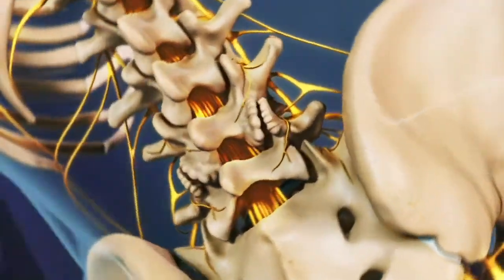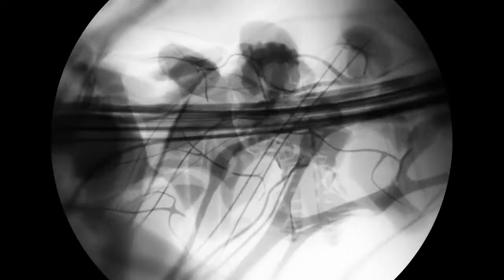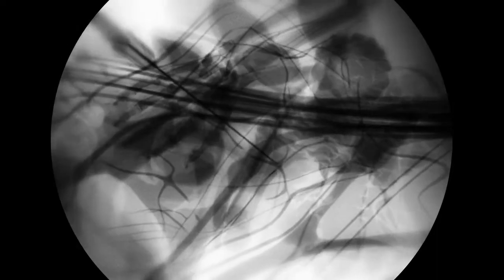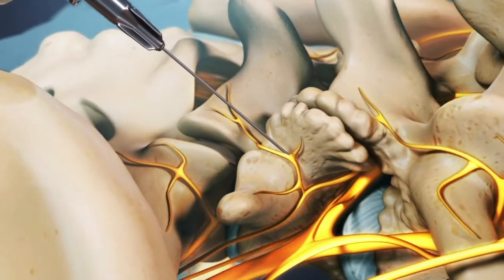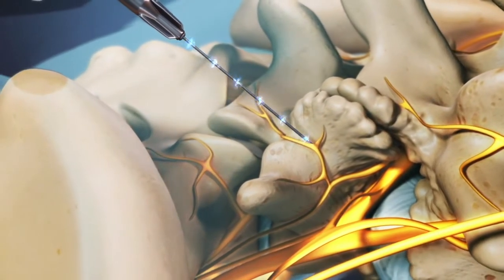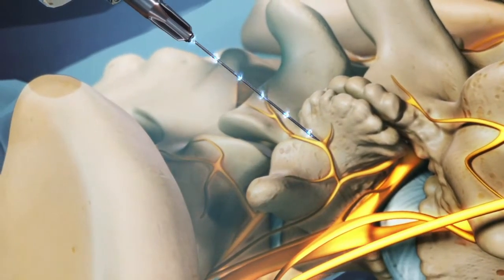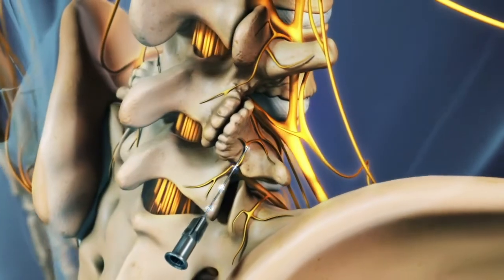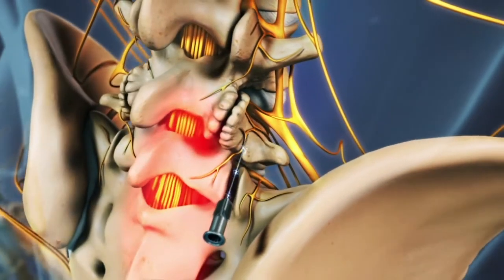Next, the physician uses x-ray guidance called fluoroscopy to direct a special radiofrequency needle alongside the medial nerves. Often, a small amount of electrical current is carefully passed through the needle to assure it is next to the target nerve and a safe distance from other nerves. This current should briefly recreate the usual pain and cause a muscle twitch in the back.